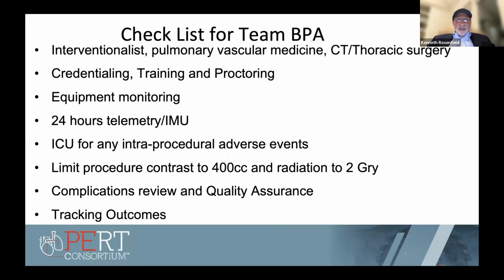Here's the checklist. You've got to have capable people that are credentialed, trained, and proctored, monitoring equipment, and so on. I'm the only one that's been doing it at my place, but my fellows have been learning, and Vlad is one of them. He's now a superstar, but I'm now training another person in my place because it's a lot of work for one person, and it's a lot of radiation.